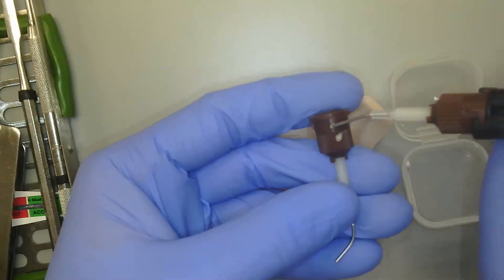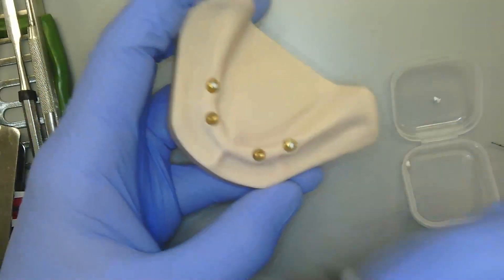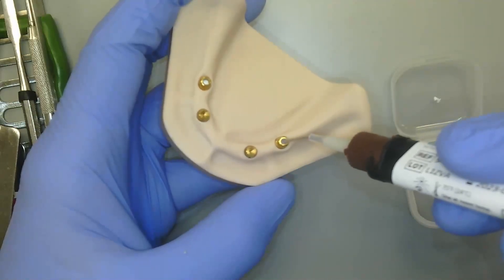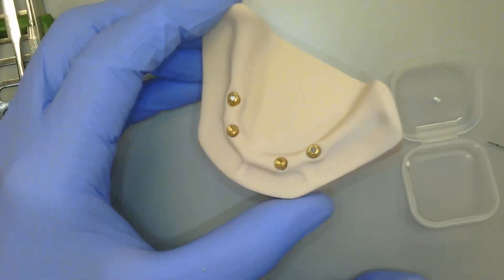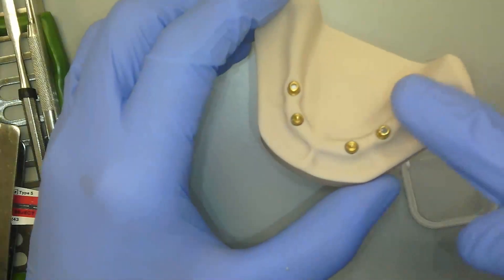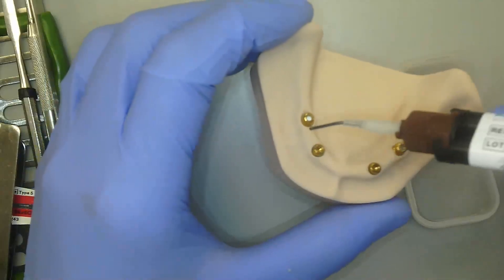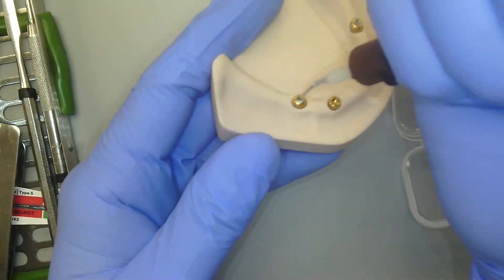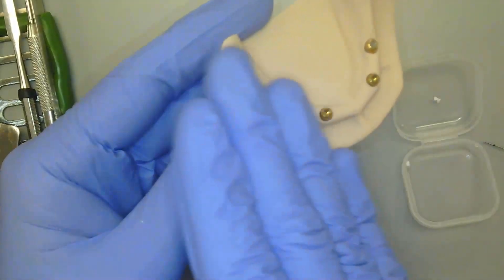This material is really ideal for this application because it flows so easily. I'm going to place this tip just on the inside of my locator angled abutment, give it a little pressure, and pull it back as I fill it up. The key here is do not overfill your locator angle. I can grab my little plastic instrument and pull that material, or just dab it with my finger and it flows right into place. If I'm going to err on the side of slightly overfilling or slightly underfilling, I would much rather err on the side of slightly underfilling.